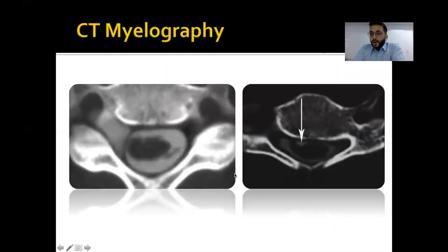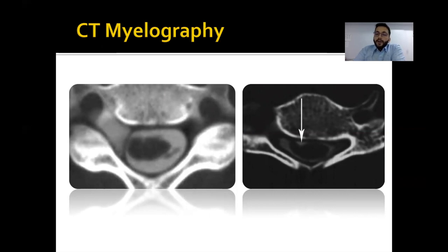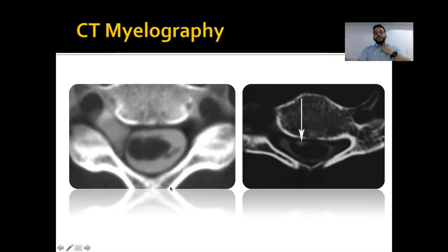Sometimes CT myelography is required — for patients in areas where MRI is not available, or patients with pacemakers who cannot urgently undergo MRI. In such cases, CT myelography can be used. This is a patient with similar findings: the ventral and dorsal rootlets are seen on the left side but not on the right, and there is contrast pooling in a pseudomeningocele sac — confirming nerve avulsion on CT myelography.